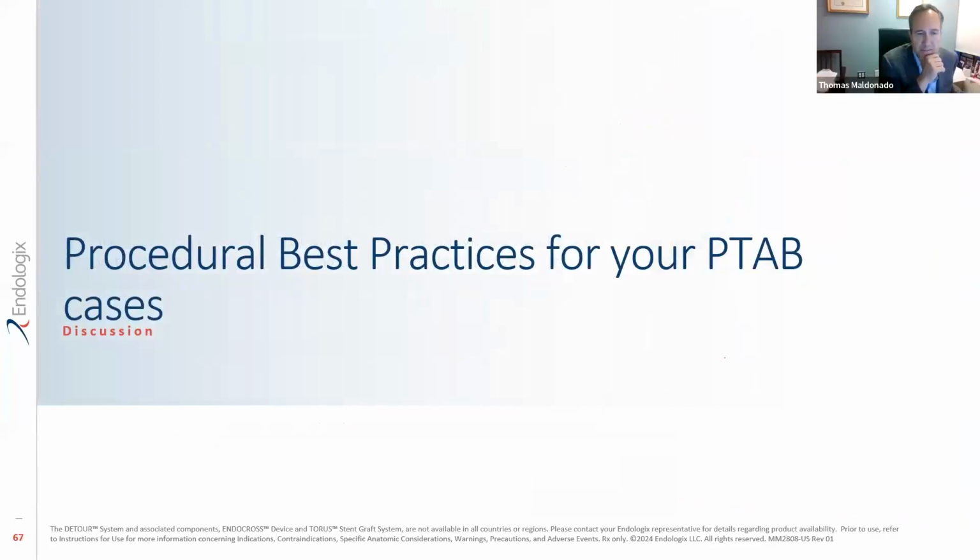There's a question about TPA, if you saw any DVT. I guess I would be worried that maybe in the setting of their arterial anastomosis and sort of controlled rupture with a balloon about giving any TPA. I don't know. Agree. I think I'd be more comfortable placing them on anticoagulation and seeing how they go. Yeah, we do have the data from DETOUR 2 in the 7 patients who did develop DVT. They all resolved just with simple anticoagulation alone. So I think that probably would suffice.